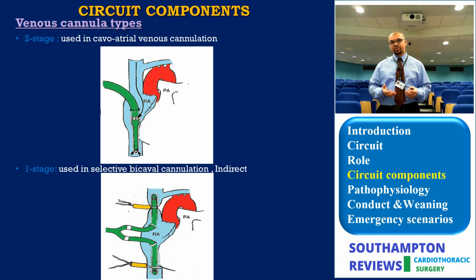If you're doing a CABG or AVR, you don't need fully decompressing of the right side. You don't need the difficulty of the direct venous cannulation. You might consider cavoatrial cannulation. Having said that, some surgeons routinely go for indirect bicaval cannulation, of course not direct, for all cases, to achieve better decompression, reduce rewarming, achieve better drainage of the coronary backflow, less obscuring of the field, better technique.